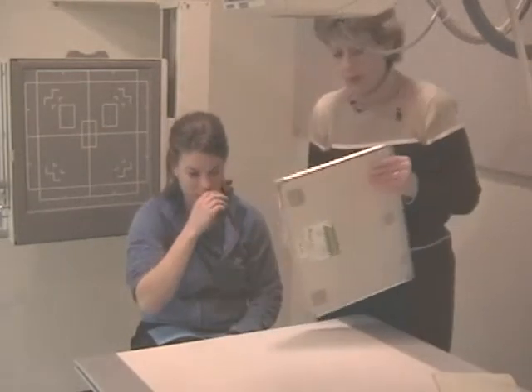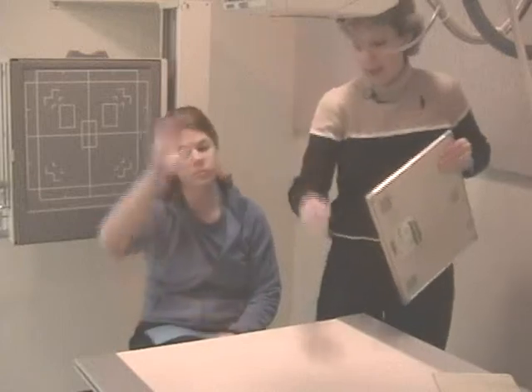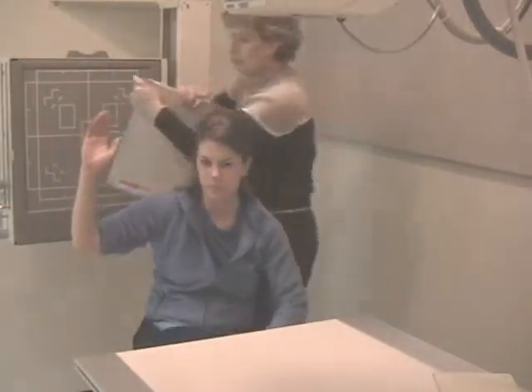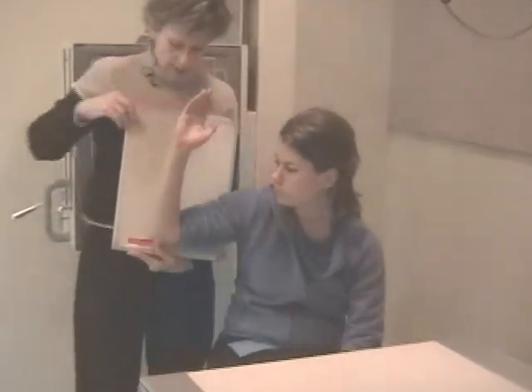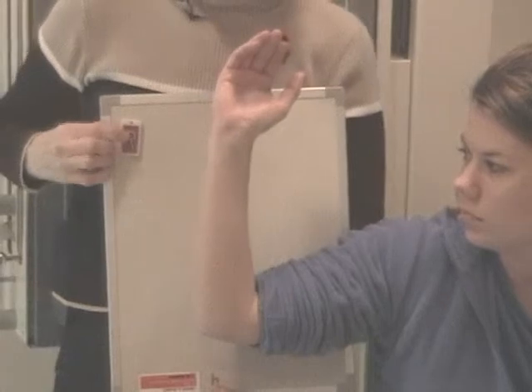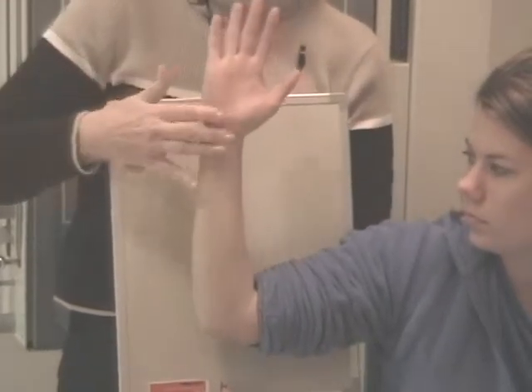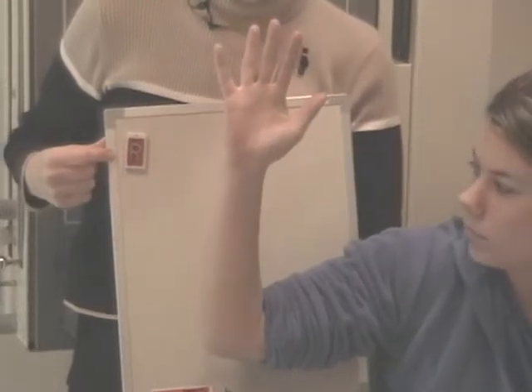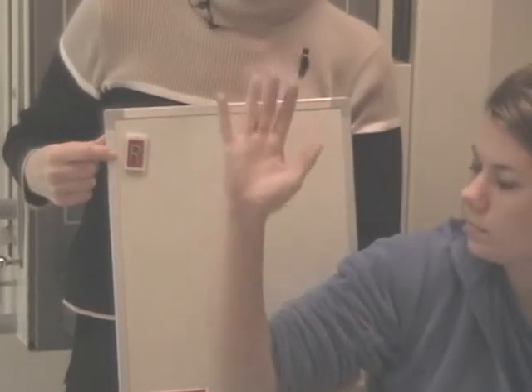And Dre, can you just hold your arm up in the air? I want to show them this marker. This is the relationship. The x-ray is going to be hung fingers up. So make sure you put your L's and R's. I want to make sure you see that, how you can read that marker there. Okay? Think of fingers up. And that's your forearm.